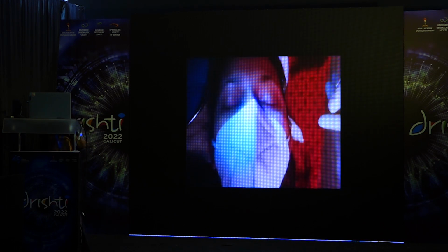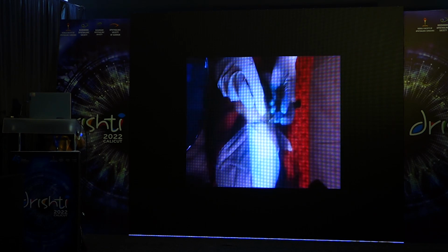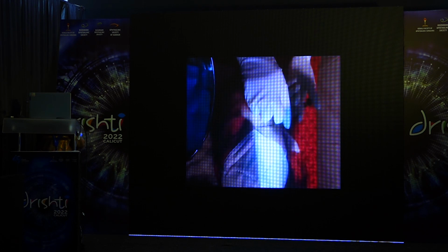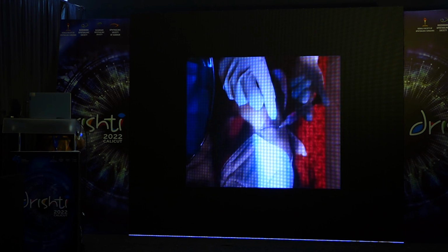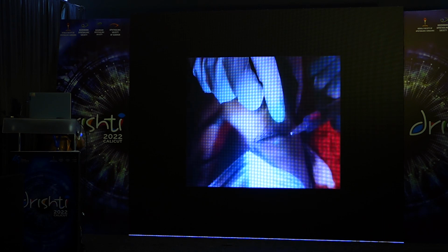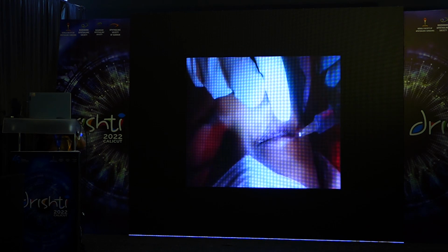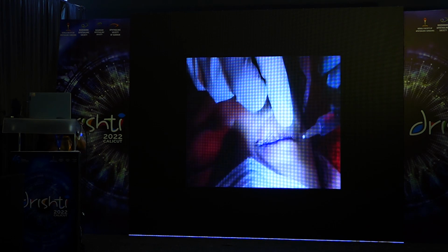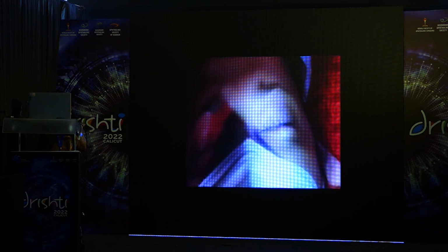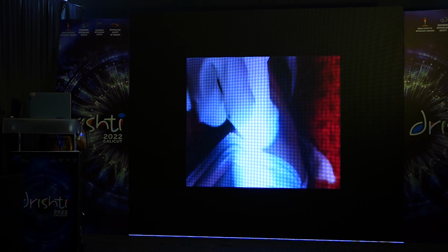So after cleaning and draping, we are giving a local anesthetic infiltration to the area where the chalazion is located. Usually lignocaine with adrenaline is given, 2% lignocaine. Give a gentle massage.